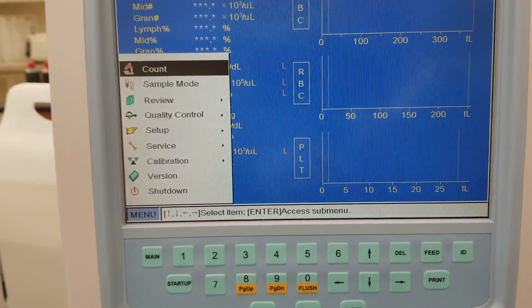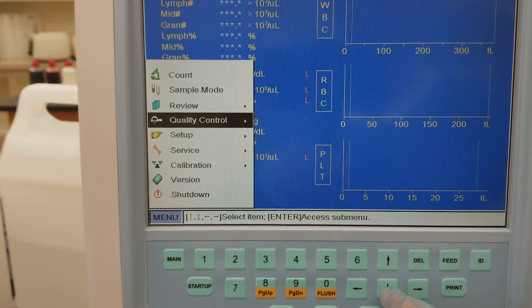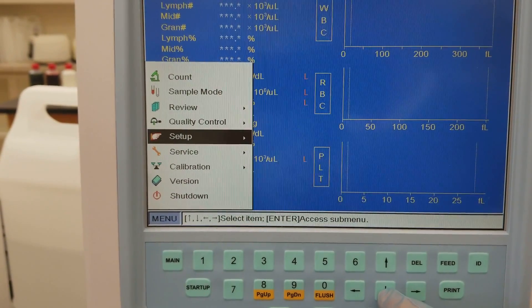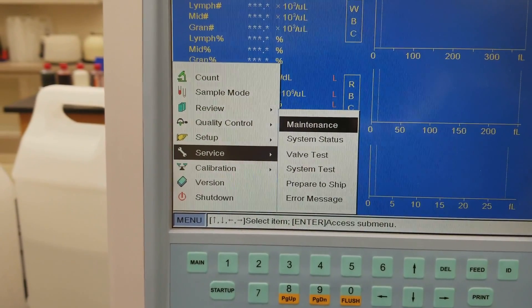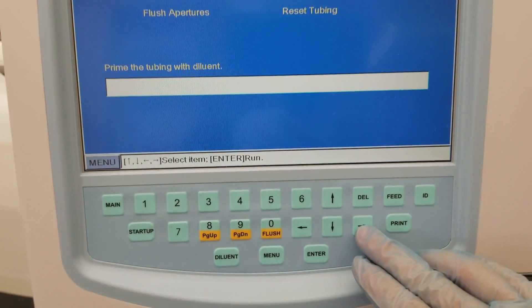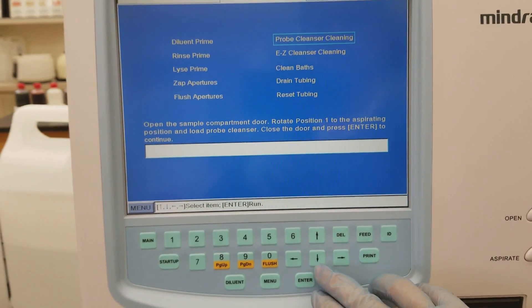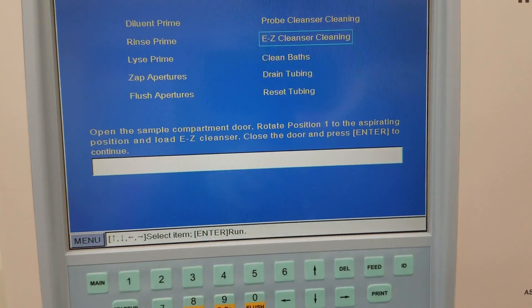So we're going to go down to Service, go to Maintenance, press Enter, and then arrow over to the Easy Cleanser. Notice it says to open the compartment door.